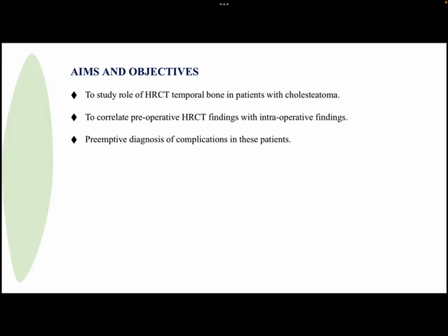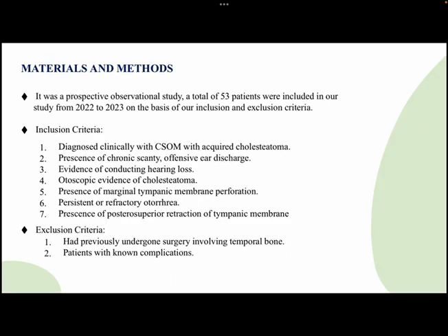Aims and objectives: to study the role of HRCT temporal bone in patients with cholesteatoma, to correlate preoperative HRCT findings with intraoperative findings, and preemptive diagnosis of complications in these patients. Material and methods: it was a prospective observational study. A total of 53 patients were included in our study from 2022 to 2023 on the basis of our inclusion and exclusion criteria.